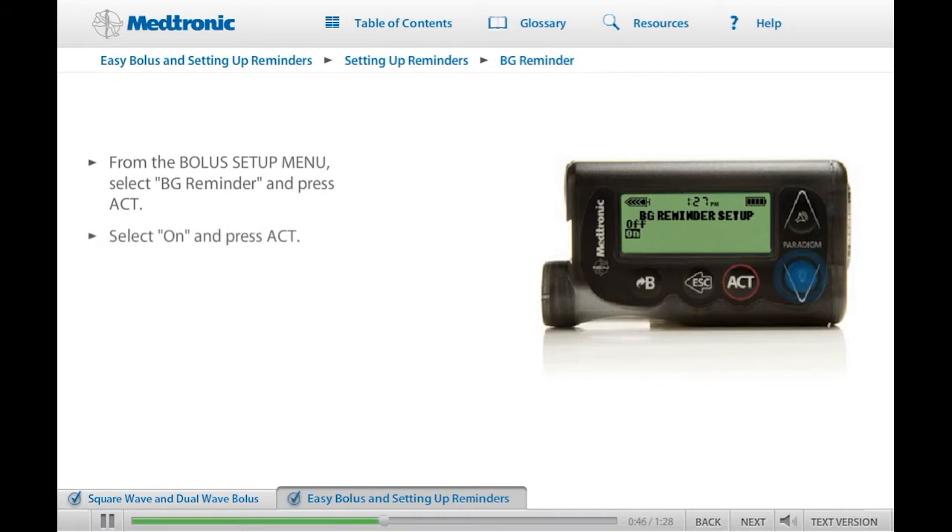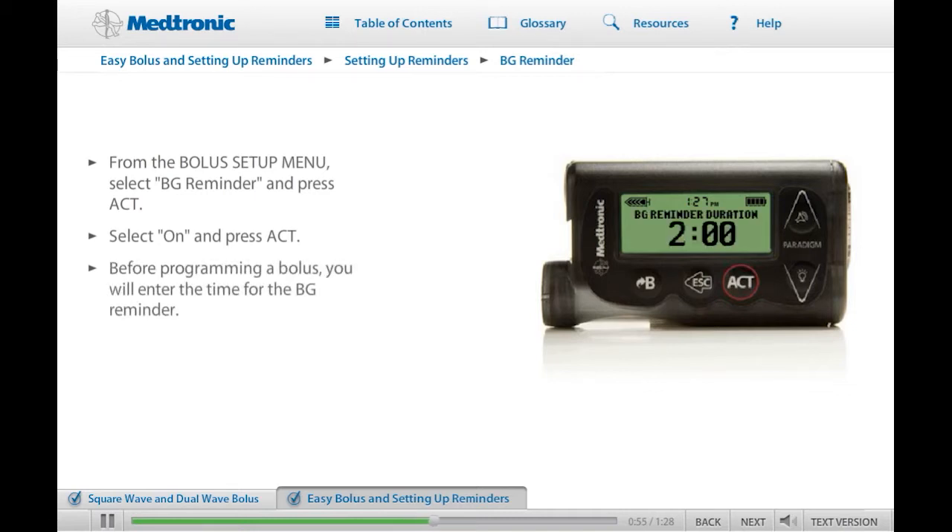Select On and press Act again. Once the BG Reminder feature has been turned on, each time you program a bolus, your pump will ask you for the length of time after the bolus you want to be reminded to check your blood glucose. To program the reminder, simply enter the length of time — 30 minutes to 5 hours, or none — on the BG Reminder Duration screen and press Act. If you do not want a reminder for that bolus, simply press Escape when the BG Reminder Duration screen appears. Turn on the BG Reminder feature and practice setting a BG Reminder now. When you are ready, click Next to continue.